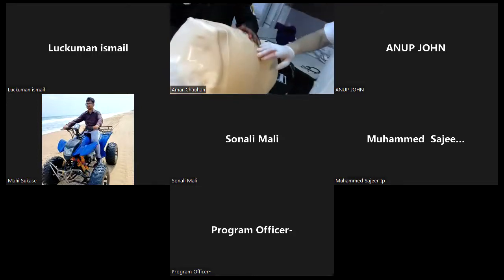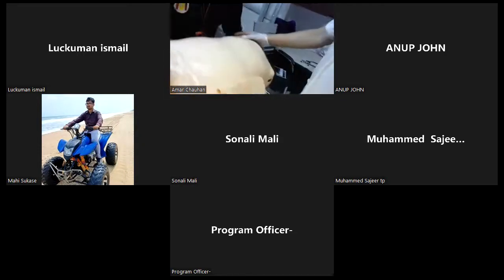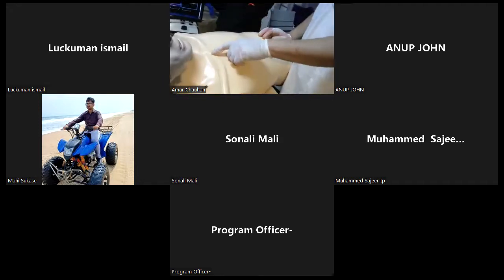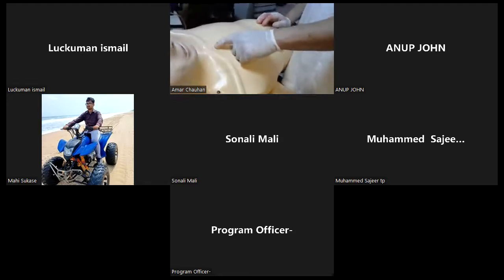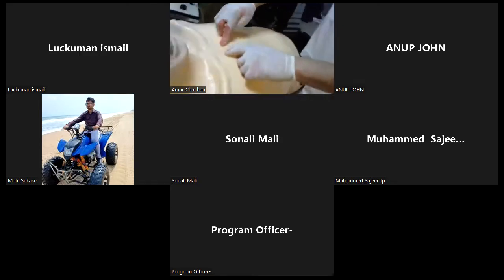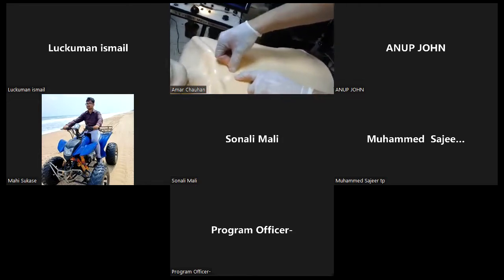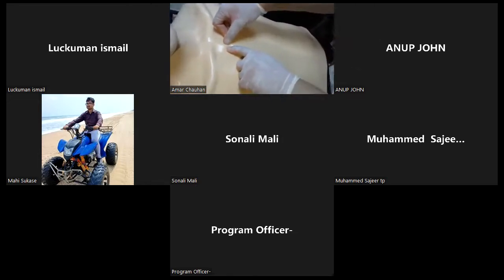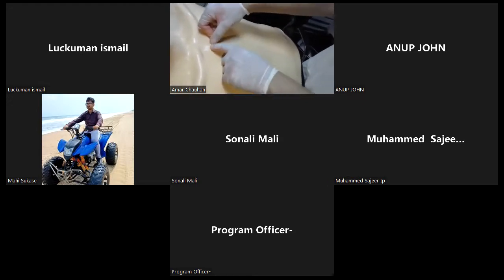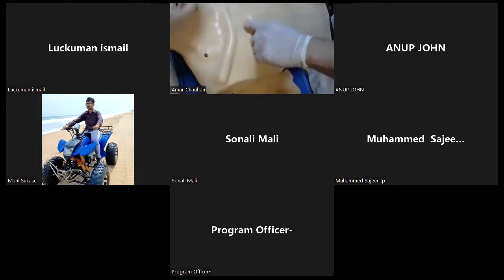The chest belt is replaceable; after 4 or 6 uses you can replace the chest belt. These are the clavicles. Can you see, Dr. Ajit? And this is the sternal notch. Just below the sternal notch, this prominence is the sternal angle. You have to count the rib spaces, and whenever you count, you start from the sternal angle. The second rib is attached to the sternal angle, and the space below the second rib is the second intercostal space.